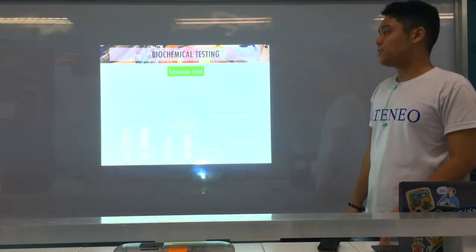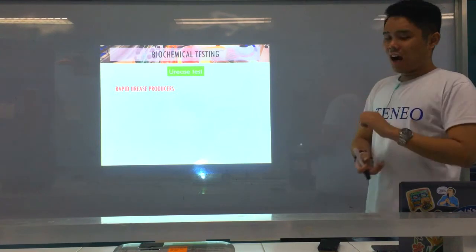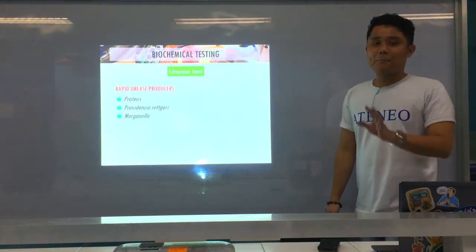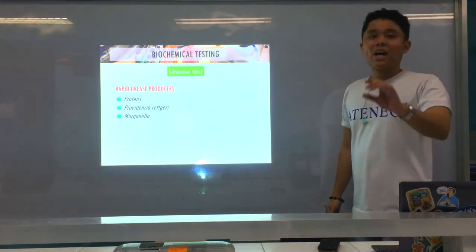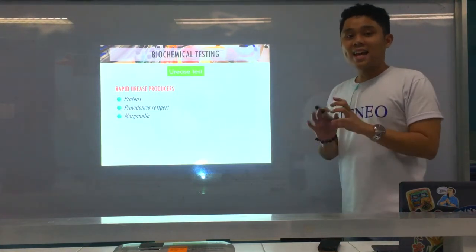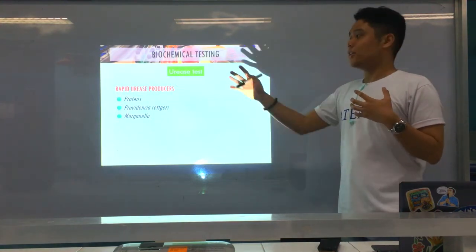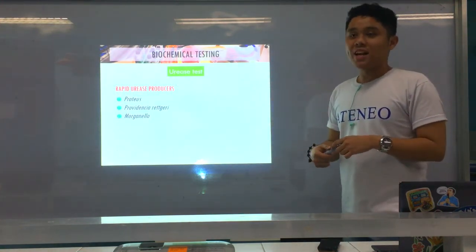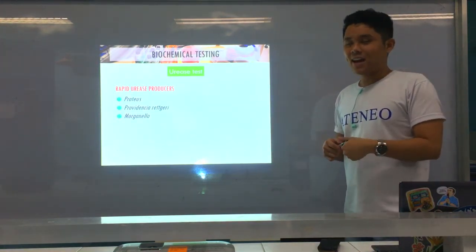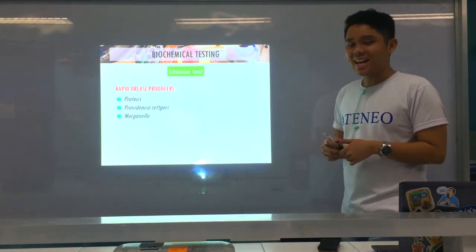Okay? Alright. And which are the urease positives? We have the rapid urease producers, meaning they produce urease very quickly, which is of course the PPM: Proteus, Providencia rettgeri, and Morganella. Recall in our IMViC, Providencia rettgeri and Providencia stuartii have the same IMViC profile. So how do we differentiate the two? You could use urease. Providencia rettgeri is positive for urease. Providencia stuartii is negative. So again, they always go together, PPM: Proteus, Providencia rettgeri, and Morganella.